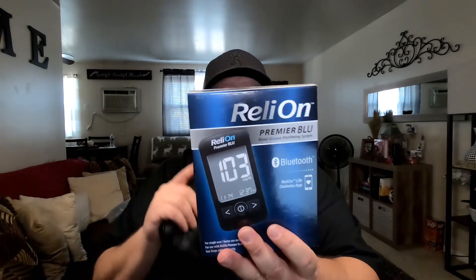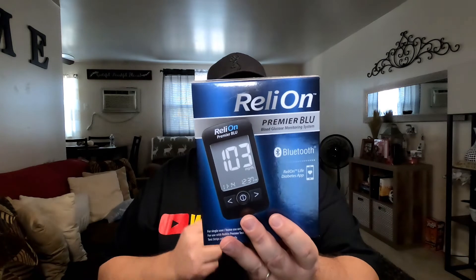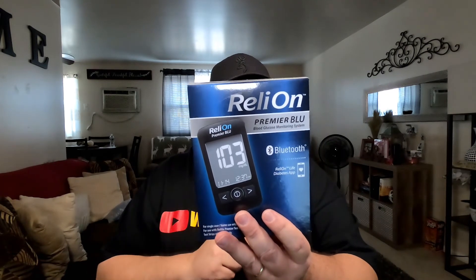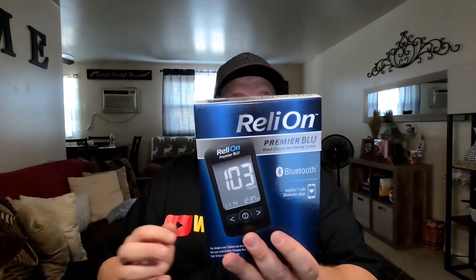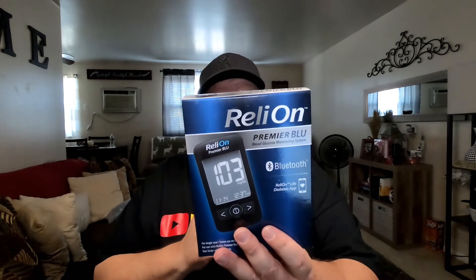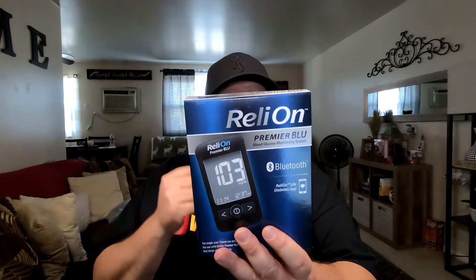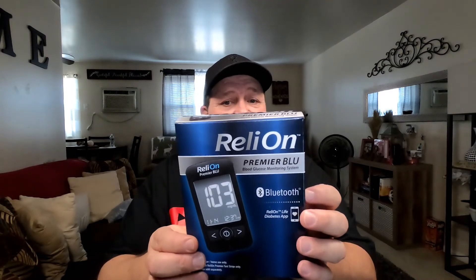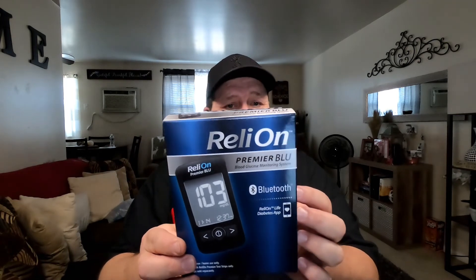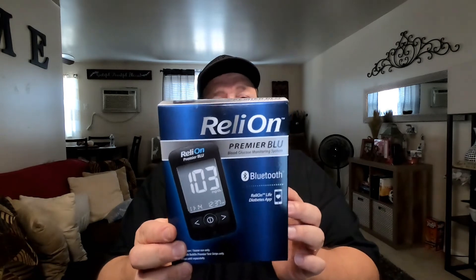This is the RelyOn Premier Blue blood glucose monitoring system — a full-featured system with Bluetooth wireless technology that connects the meter to a cloud-based portal through the RelyOn Life app on your smartphone. The app makes test results available any time on iOS or Android, eliminating paper logbooks. Key features include total pre-meal and post-meal test averaging, a hypoglycemia indicator, and a 1000-test memory, with compatibility with RelyOn Premier test strips.